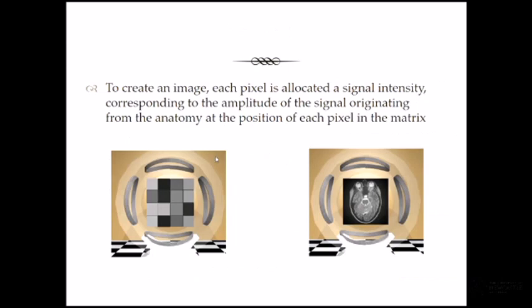And the way that looks is, if we just think about how we've now taken our phase and all our frequency information, and we've now assigned it as a pixel intensity. Again, this is 4 by 4, which is a rather coarse matrix and would not be done. But if we think about making that a very fine matrix, you can now start to see how these blacks and different shades of grey then represent our image.